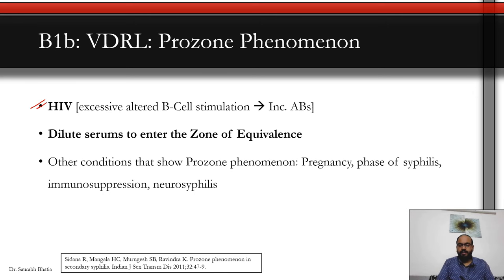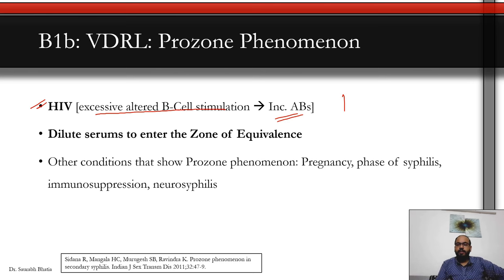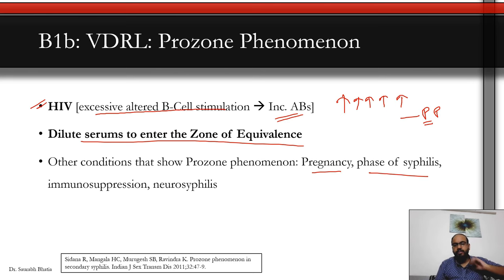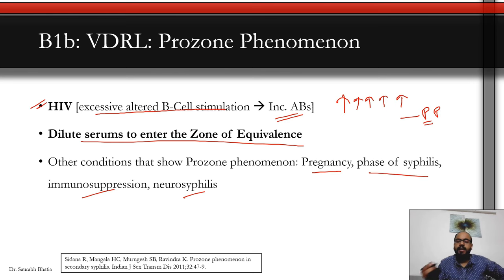Prozone phenomenon is most commonly seen in syphilis with HIV, where excessive altered B-cell stimulation produces high antibody concentrations that interfere with the VDRL test. Other conditions causing prozone: pregnancy, early syphilis (high initial antibody bombardment), immunosuppression, and neurosyphilis (where treponemes in CSF continuously generate antibodies that leak into serum but antigens in blood are relatively fewer).